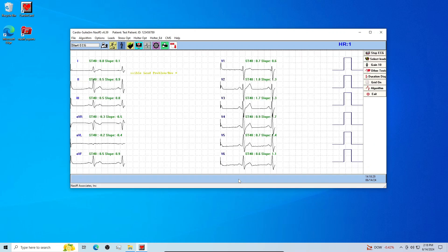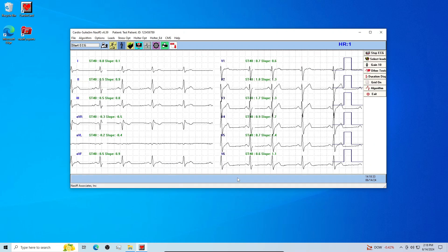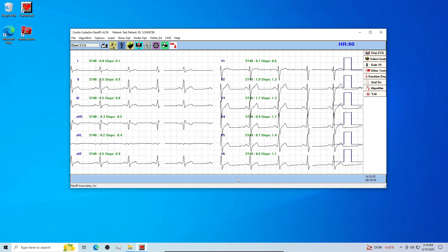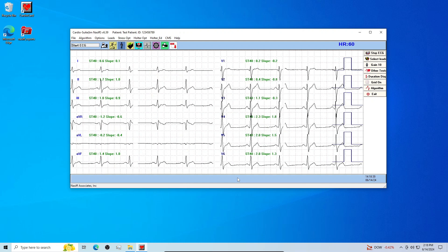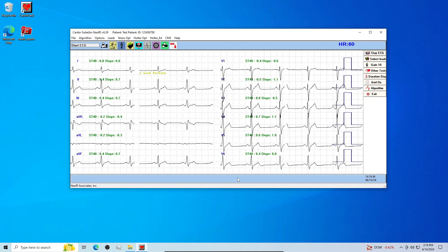Allow the signal to normalize. Verify that the patient is well connected and that there is low artifact in the tracing. Watch the produce graph to be sure your patient is well connected.